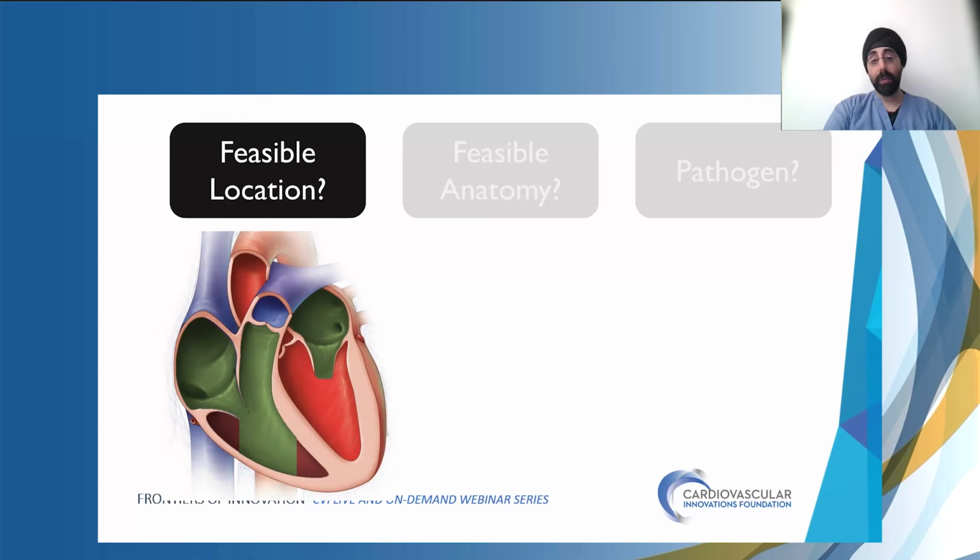Yeah, it's a really good point. I mean, especially when we first started, and this was several years ago, we were sort of worried: are we damaging the valves? Are we damaging native material when we do this procedure? But in all of the past studies I have sent, I have not gotten a report back that it was valve tissue. It's always been sort of pure vegetation. I don't know if your guys' experience has been any different.